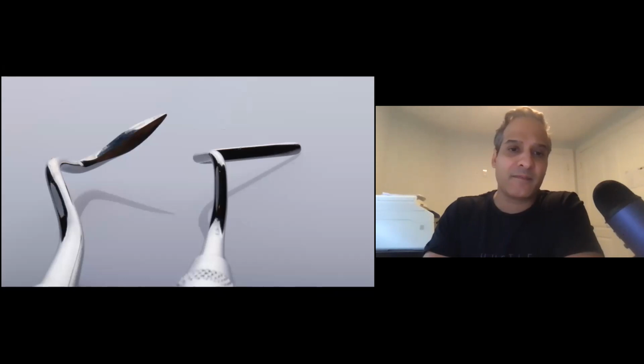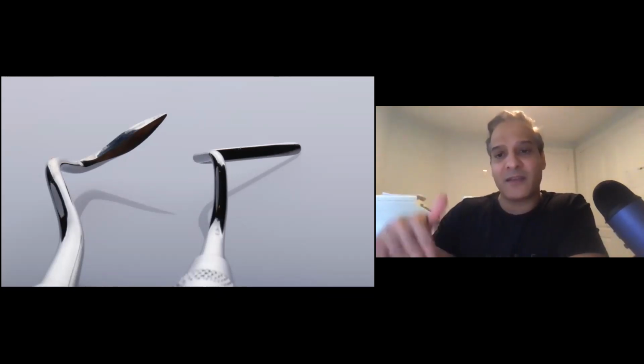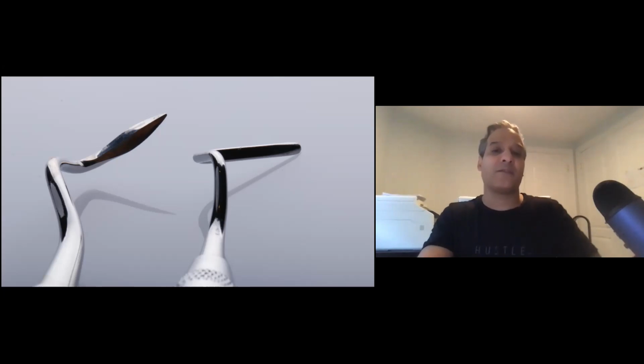The first one is an Orban knife. This is used to internally release and dissect the tissue to allow coronal positioning. And the other instrument on the right is an interdental knife. Basically, this just slides into the sulcus down to the bone to start to lift the papilla. I use these to start to create my tunnels. So we're going to go through some cases.